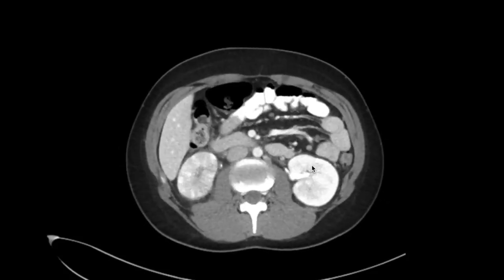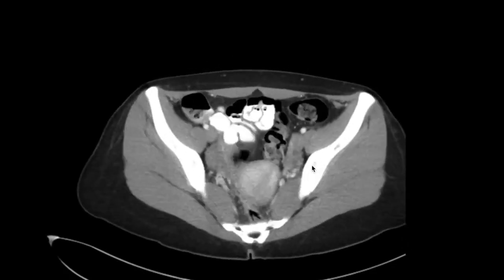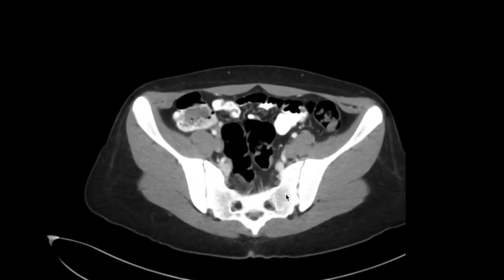And the clinical context is also very important as well. If the patient, again, has a rectal cancer, for example, and has a 7 millimeter rounded node along the superior rectal chain, that is very suspicious for being involved with cancer.